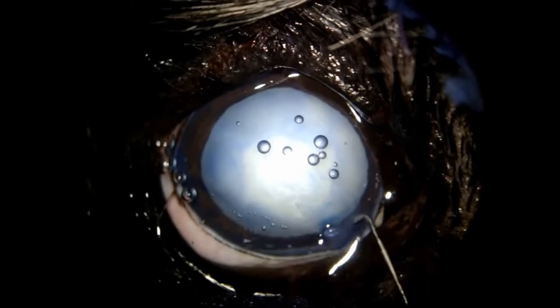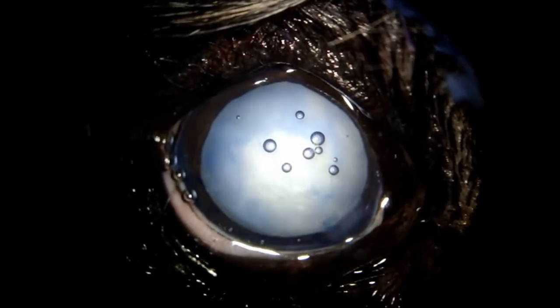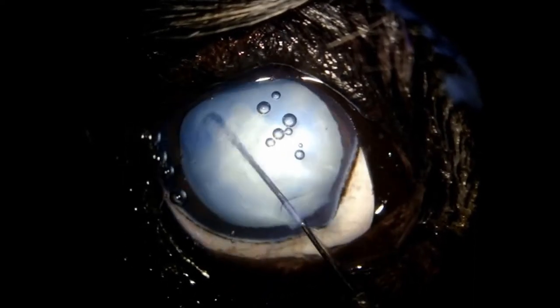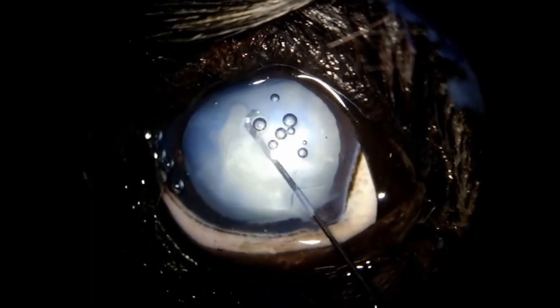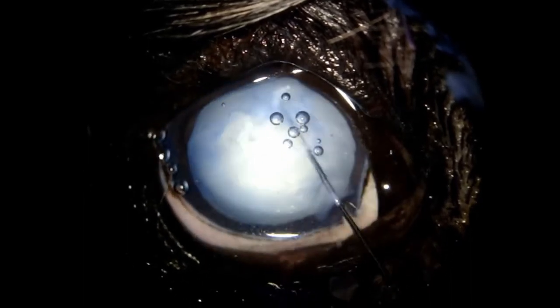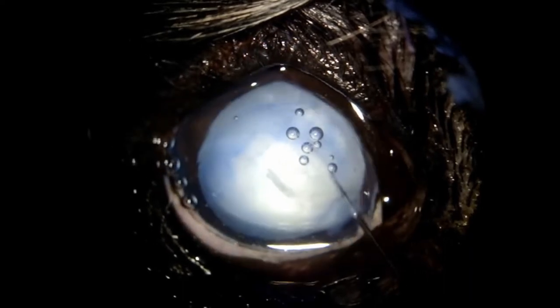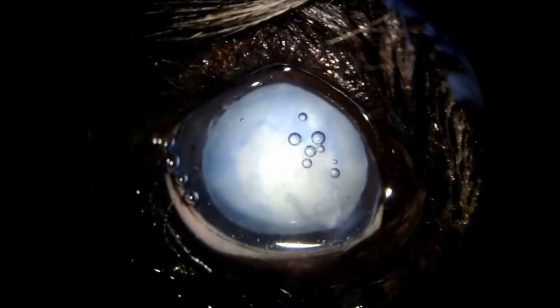Now we're going to make the cataract mobile by doing the hydrodissection. I like to flush out a little bit of the viscoelastic, so you create a path for the BSS to go outside the eye. So very gentle with a 3 ml syringe, loosening the cortical part of the cataract, both sides, right underneath the anterior capsule, until you can rotate the nucleus. Be gentle during this maneuver, otherwise you can have a posterior capsule rupture. See, it's almost free, entirely free. There you go. Okay, good.